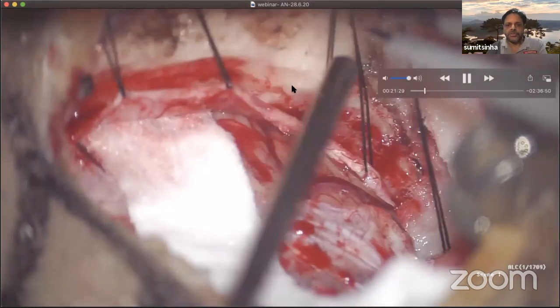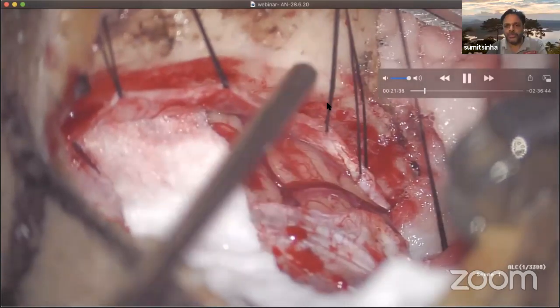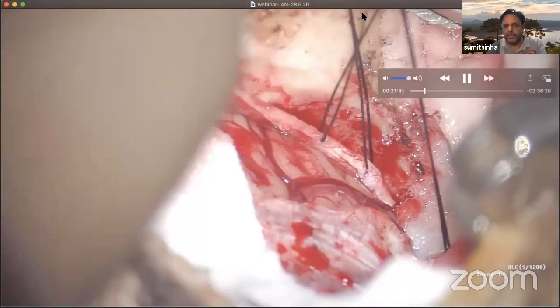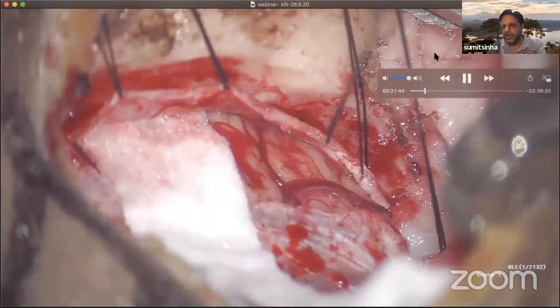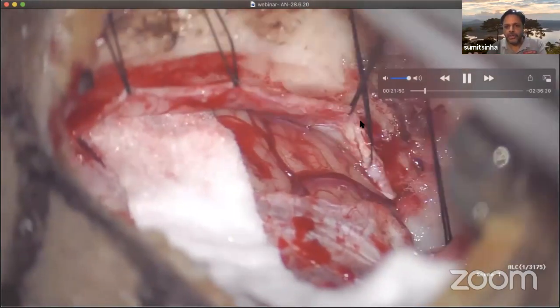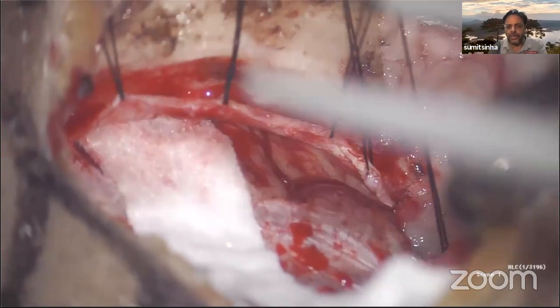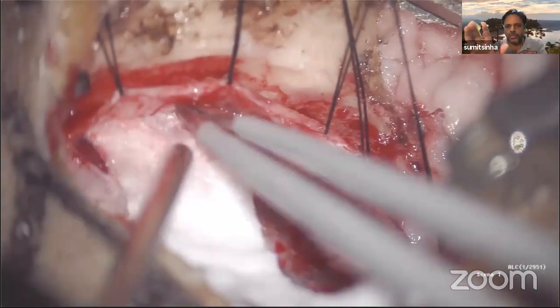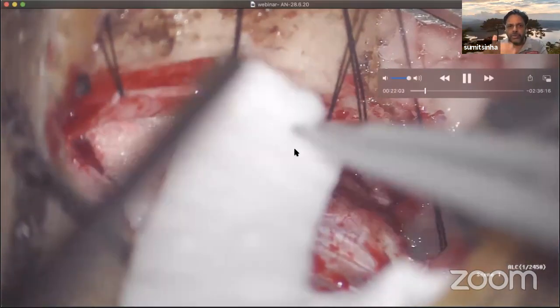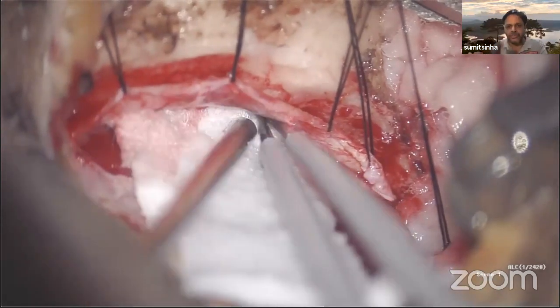Now, you see these stay sutures. These are very important stay sutures, and you have to ask your surgical assistant to pull these sutures in the correct direction. For example, this suture has to be pulled in this direction. This suture has to be pulled in this direction. When these sutures are pulled in the correct direction, then you see your vision definitely improves manifold. Your angle of vision is important. When you ask your surgical assistant to pull these threads in a correct manner, you can yourself see that your angle of vision improves considerably.